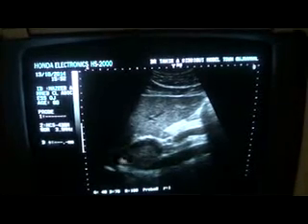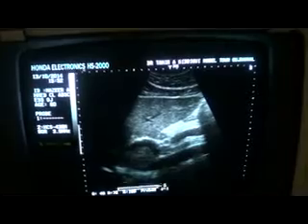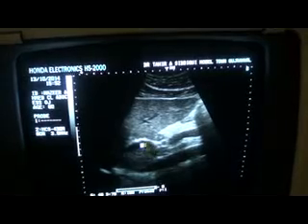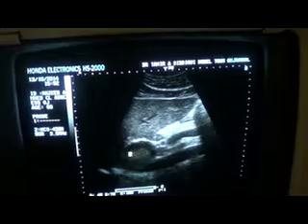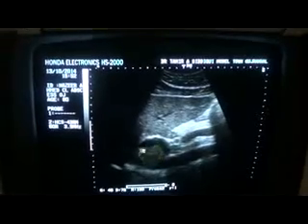This is the caudate lobe or segment 1 of the liver being bounded by a curved linear structure that is called the ligamentum venosum. So this is the ligamentum venosum, which is filled with fluid, and there is a dependent region of low level echogenic settled area within it.